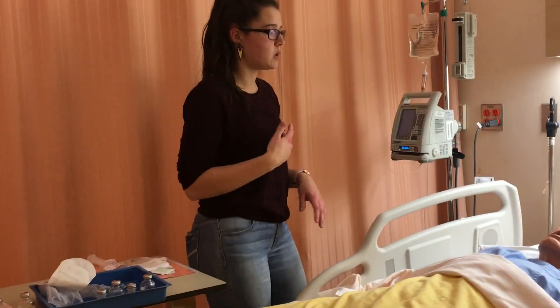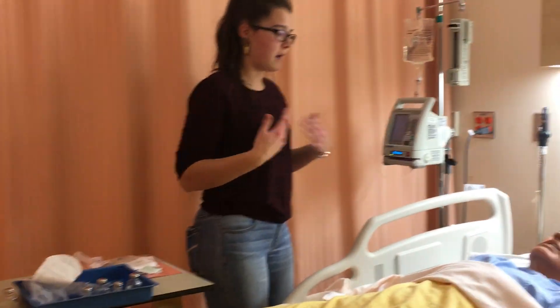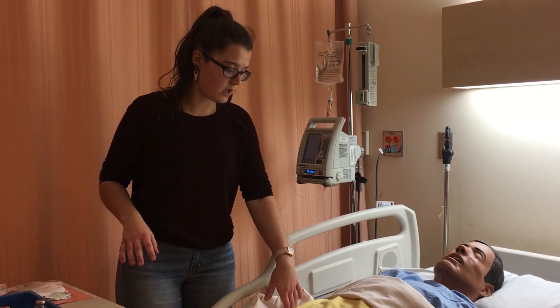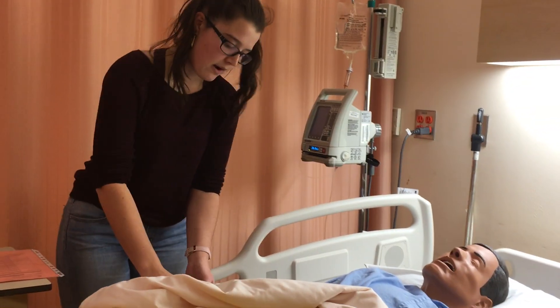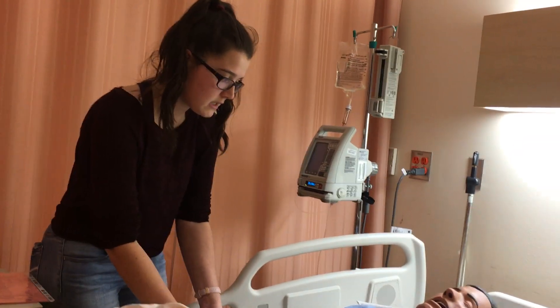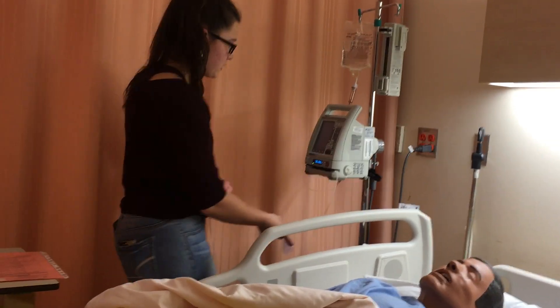Hi Mrs. Wrightson, my name is Angela Behrens and I'll be your student nurse today. I'm here to give you your cloxicillin, which is an antibiotic for your respiratory infection — that will make you feel better. You have the right to refuse. I'm going to check your armband. Could you give me your full name, year of birth, and do you have any allergies? I'm also going to check your IV site — it looks patent. Does it hurt? Has it been bothering you? The clamps are open and the rate looks correct.